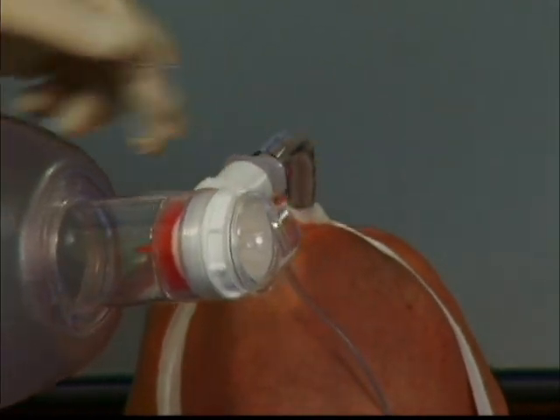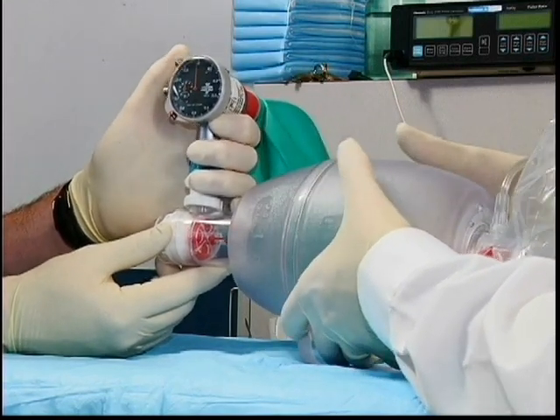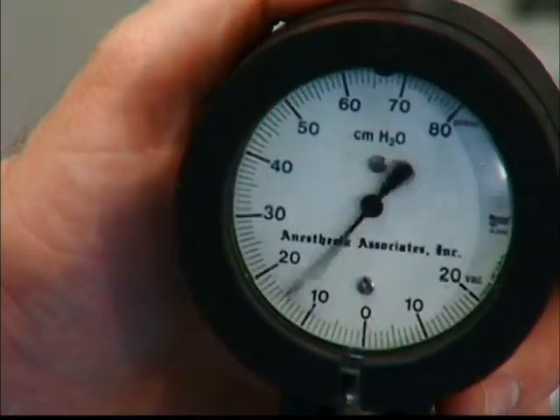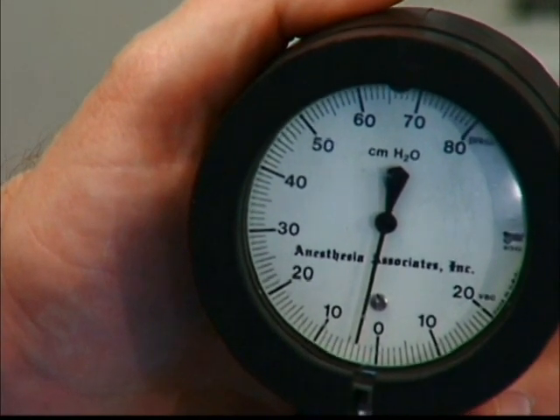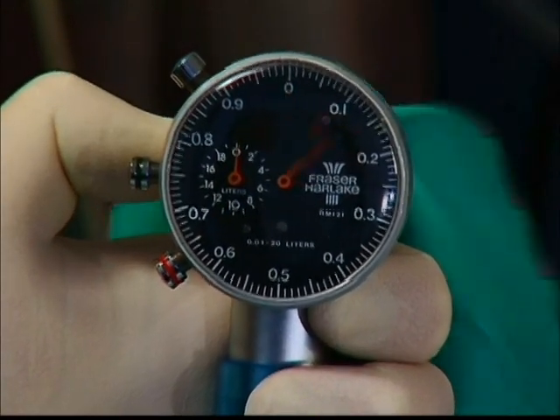There are various methods you can use to practice bagging patients, such as using a test lung. Some test lungs are not much more than sponge-like balloons, shown here. A pressure manometer can be used to determine the amount of pressure you are generating with each squeeze of the bag, and a respirometer can be used to measure the amount of air or tidal volume that you are delivering to the patient with each squeeze of the bag.